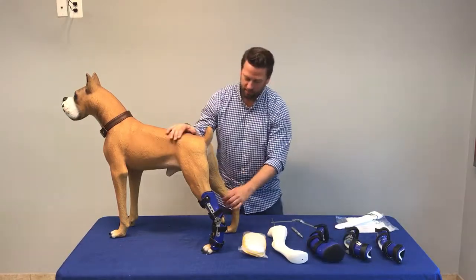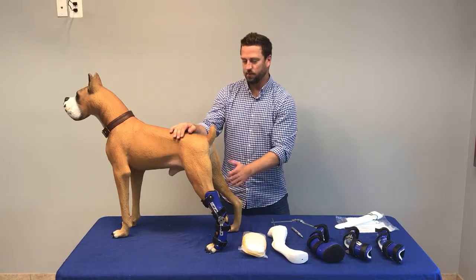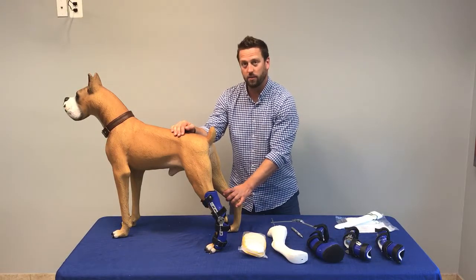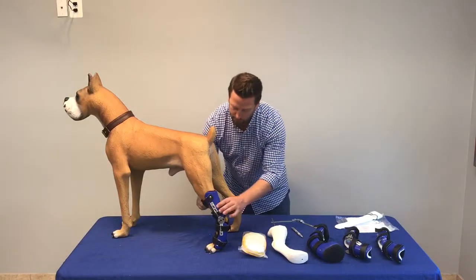I'm going to show you how to fit this device today. For fitting purposes, we use Bruno the dog. I'll show you the strapping sequence — it does not matter on how you fit a tarsal brace, unlike some of our other braces where the strapping sequence is specified.